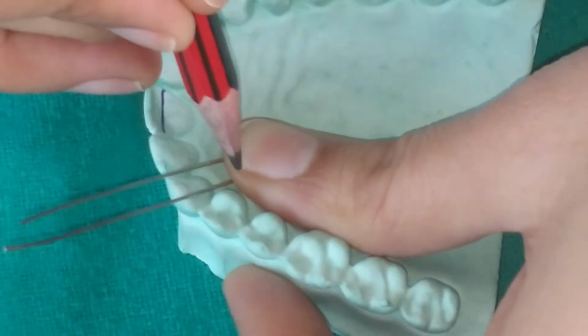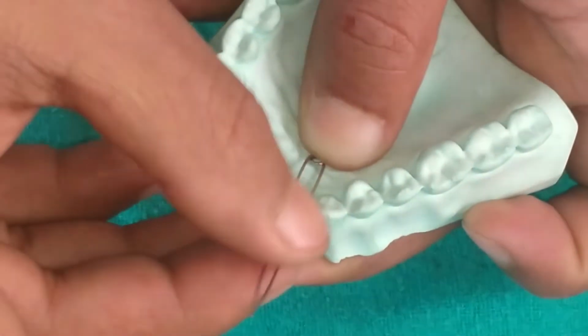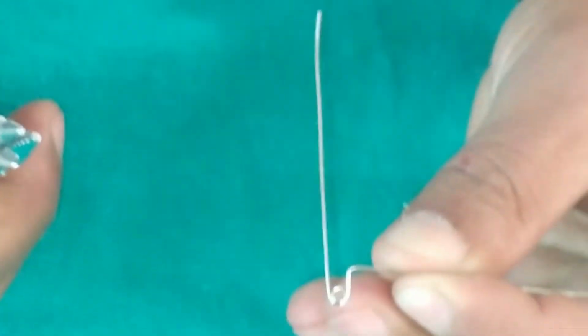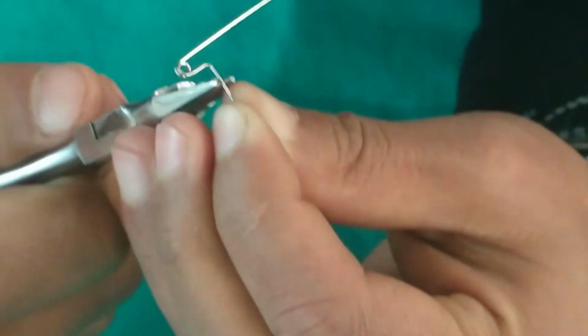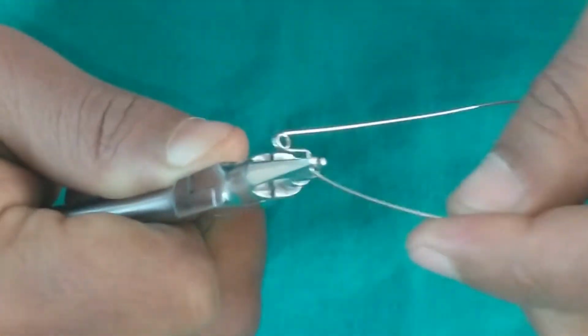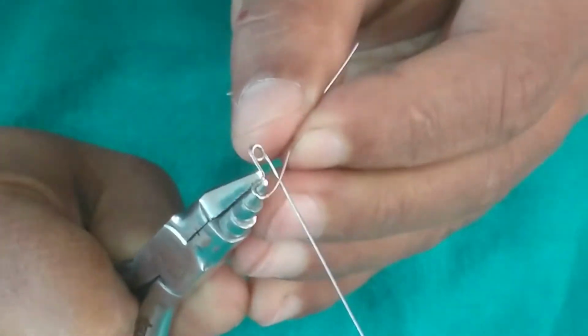Now we will adapt the active arm and retentive arm. Three to 4 mm from the helix, we are bending the retentive arm, first giving the loop, this bend, converting it into a loop. Loop should not be too wide, it should be 3 mm in diameter. This is the activation loop in the retentive arm.